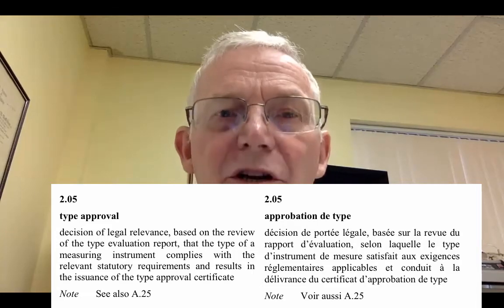But the big question for us on a day-to-day basis in our court system is, how do we make sure that a given Intoxilyzer 8000C, which is not one of the 2 original instruments submitted for evaluation, and may now be 5 or 6 or 7 years old, how do we verify that it is properly calibrated, that it was properly calibrated at the factory to the manufacturer's specifications?